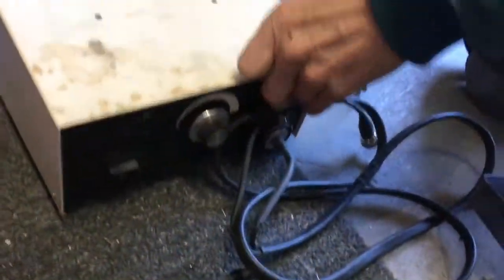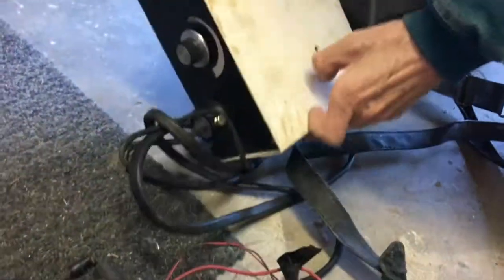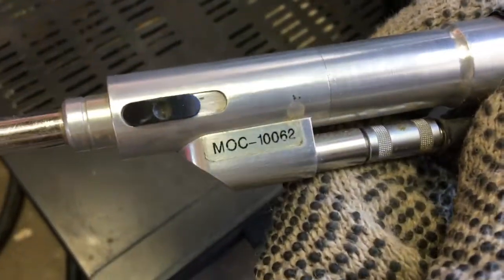Is that a Toshiba? That part there is Toshiba. I see no name on it. Well, this is the MOC 162.